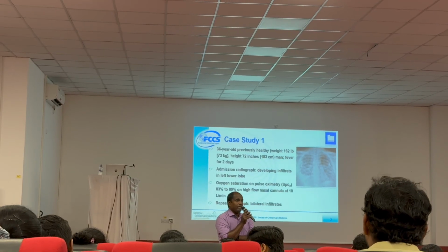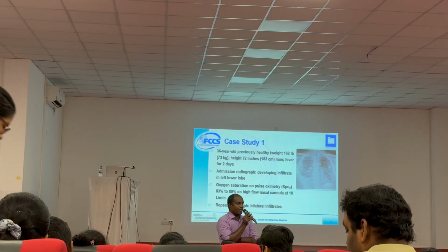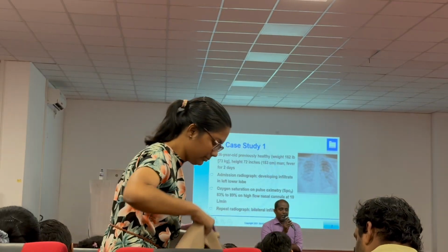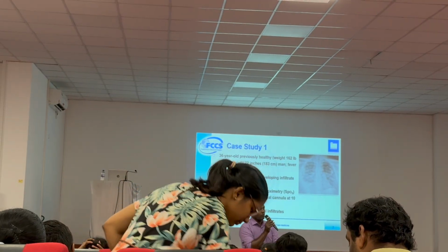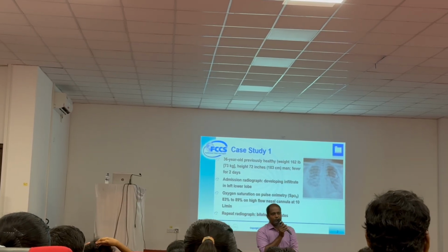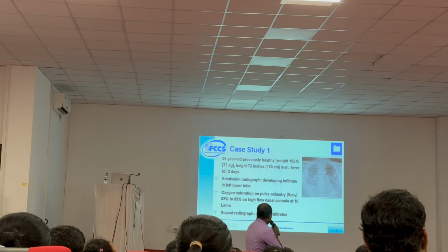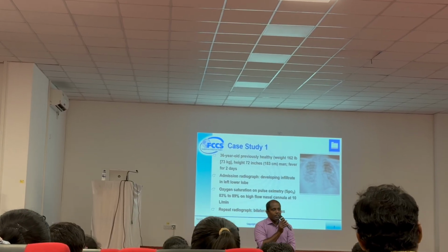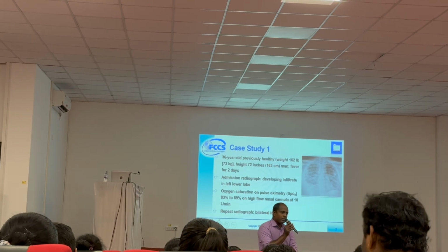Some people are struggling with both components. So we prescribe a ventilator for three reasons: to improve the oxygenation, or to improve the ventilation, or sometimes both. That's the first thing. The basics you already know from mechanical ventilation 1.